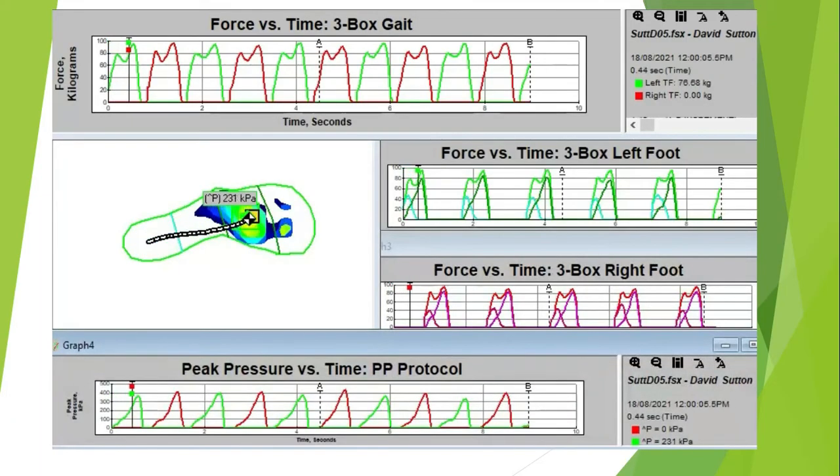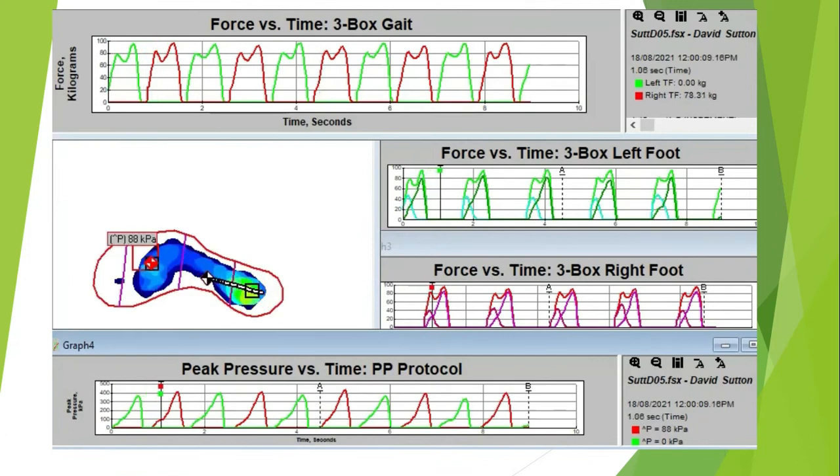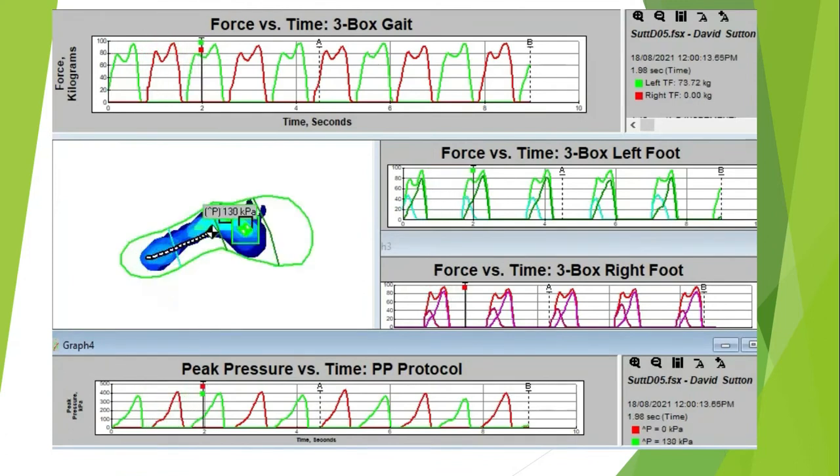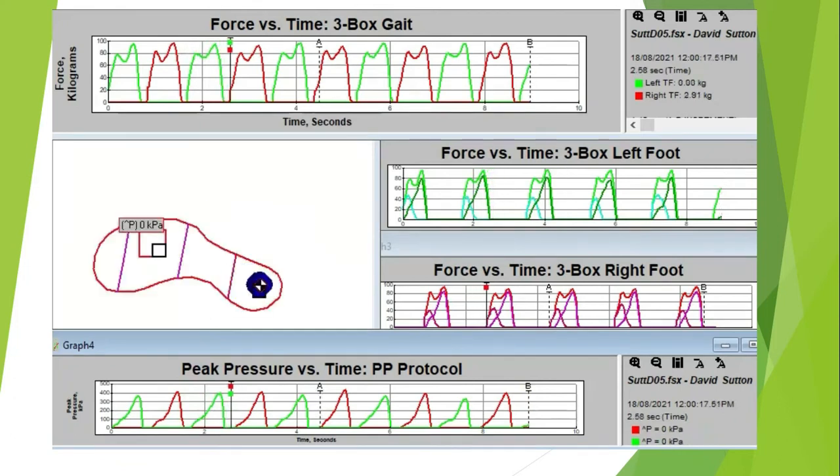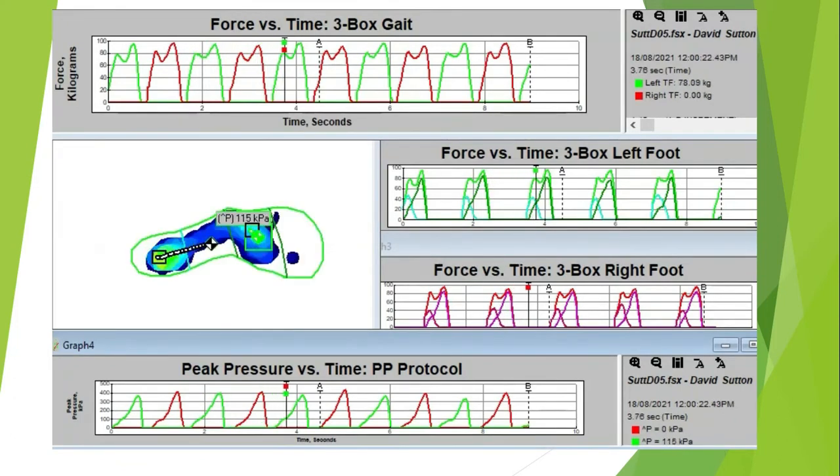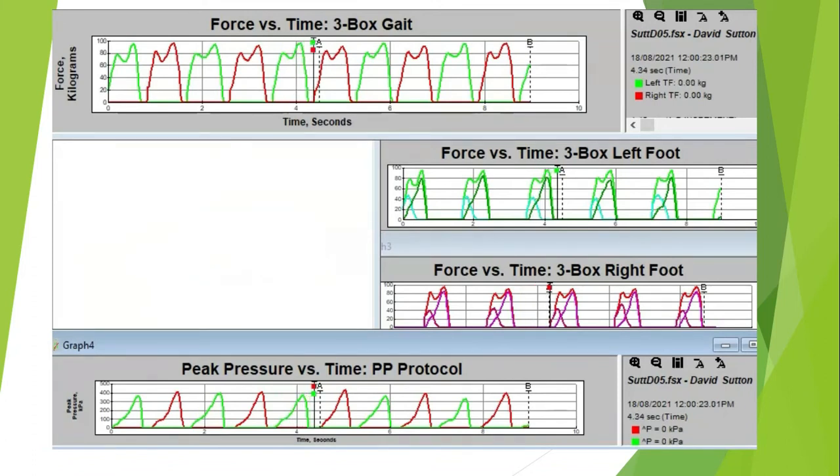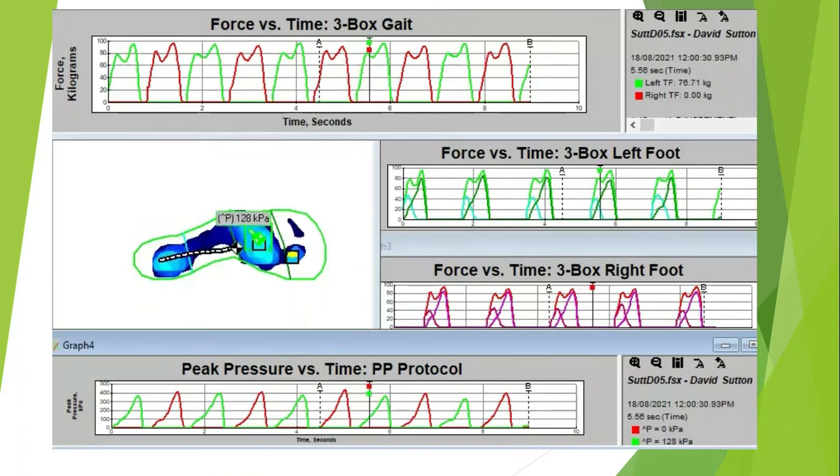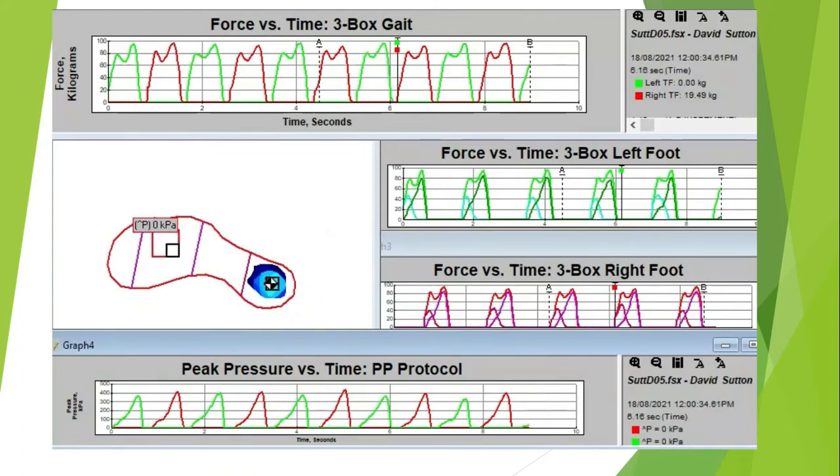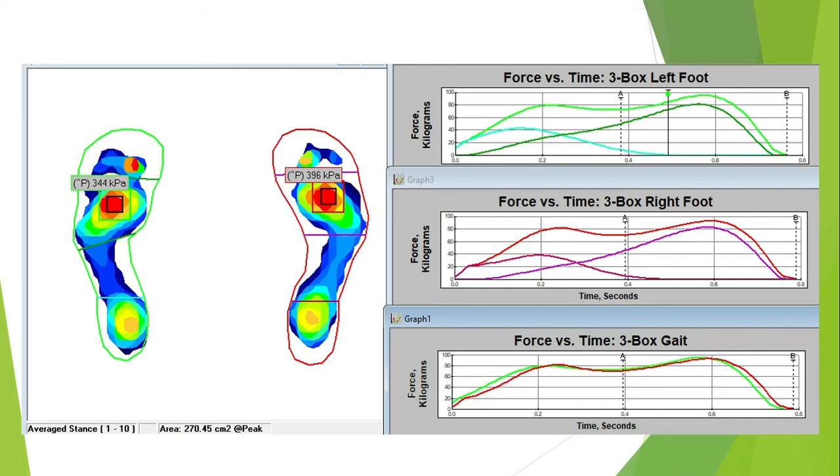So this is the data and you would get a live feed as well as a recording. You can see at the top of this screen, the ground reaction force for the left is green and the right is red. To the mid screen to the right is the ground reaction force in three box protocol. You can see the heel is separated from the forefoot in that particular graph. And down the bottom is the peak pressure timing, and that's in the metatarsal area.